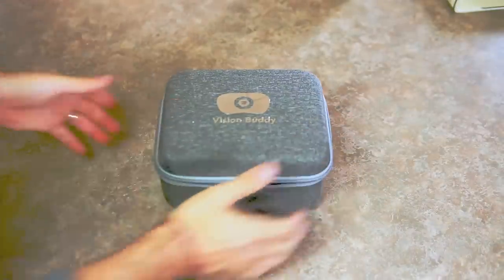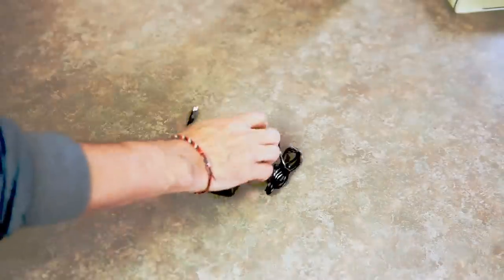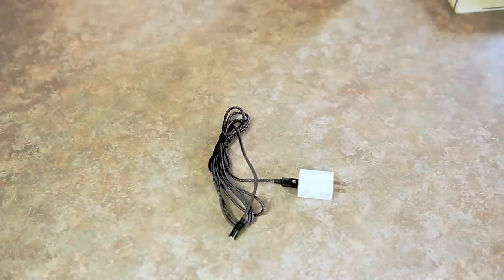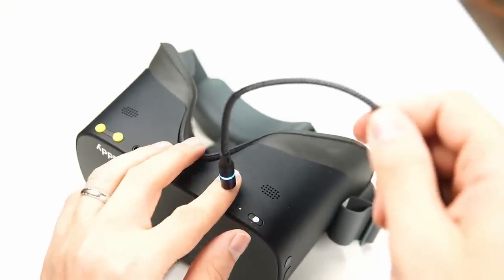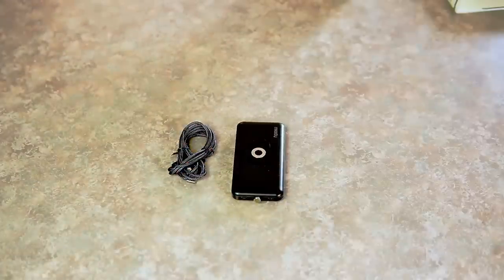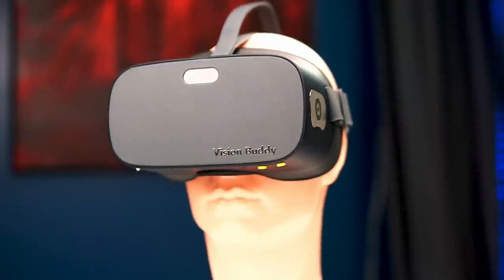Of course, you get the Vision Buddy headset, which comes in a nice gray hard case. You get the transmitter — this is what connects to your cable box or streaming media box and sends the signal to the headset. You also get different cables including power and HDMI, plus a power cable for the headset with a really cool magnetic connection that makes it super easy to charge. Vision Buddy also gives you an external power supply or power bank to extend the life of your headset.